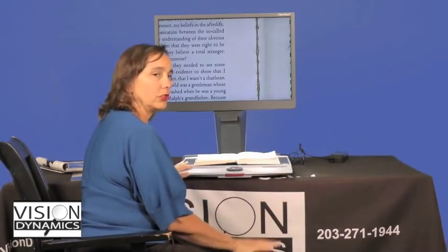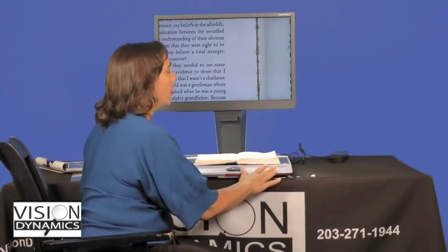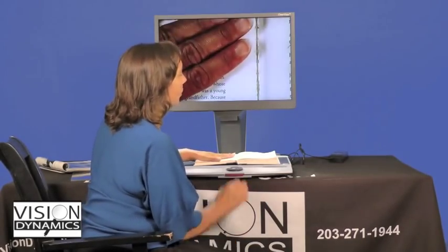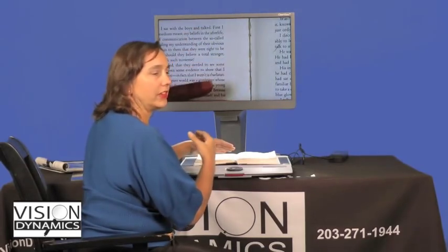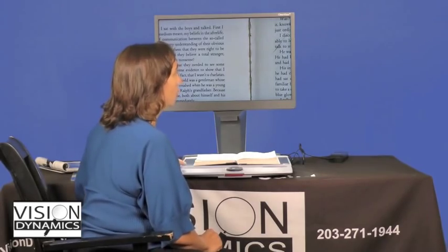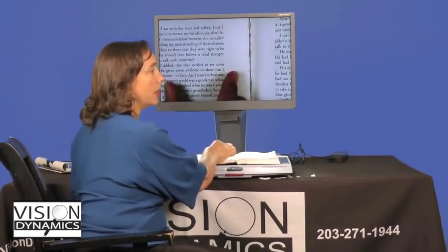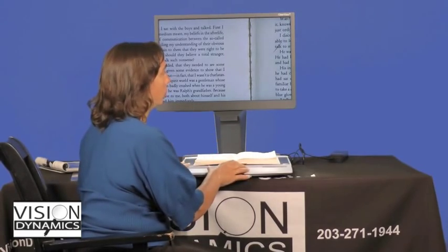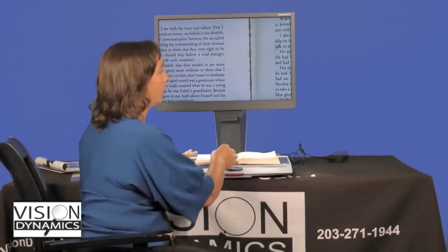Now the pencil all the way to the right, that's going to lock your focus. What that means is right now, if I stick my hand underneath there, I'll make the screen a little bit smaller. Anything closest to the camera is what the camera is going to focus on. So now it's going to focus on my hand. I'm going to take it away. Now it's going to focus on the paper. If I put a prescription bottle underneath here, it would focus on the prescription bottle. The focus is going to keep changing based on what's closest to the camera.